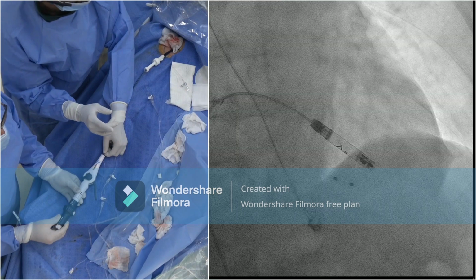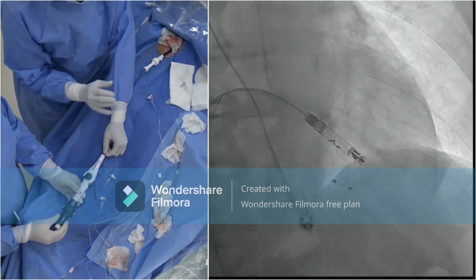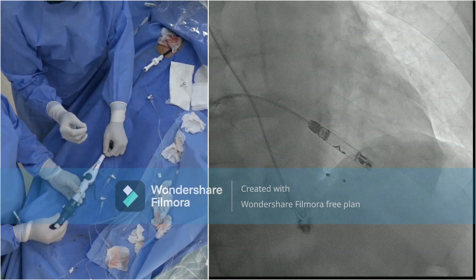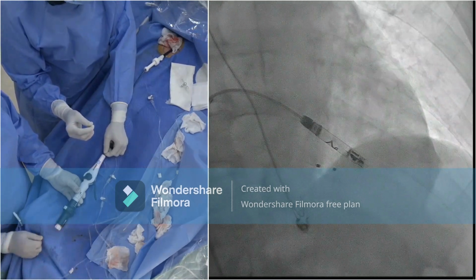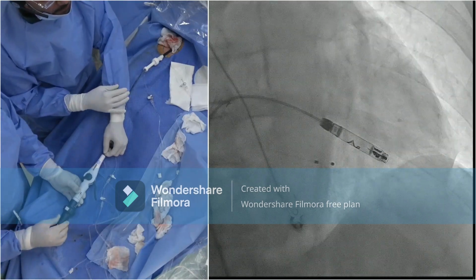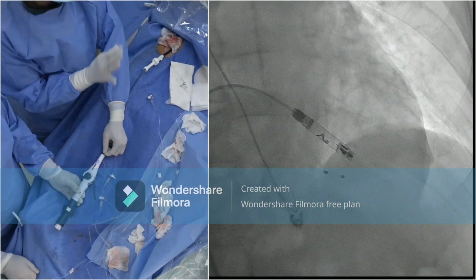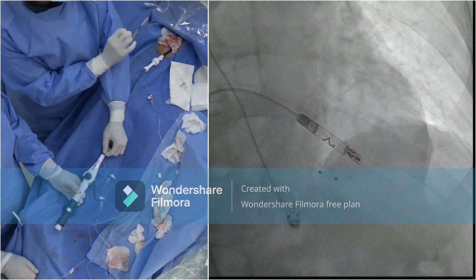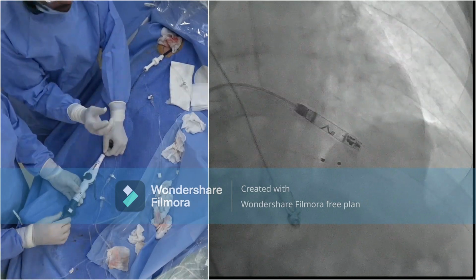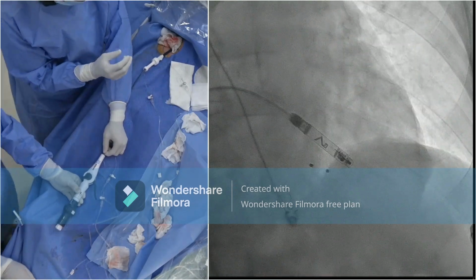And now we are rotating very carefully, very slowly. No rush at this stage. As you can see, Dr. Raed's hand, gentle movement, bit by bit, and see how it behaves. You want the torque to be transferred. Now we did 3 clicks, and it's not about the number of clicks. It's about 1.5 rotation. Keep this in mind. So we keep rotating. It started moving a little bit.